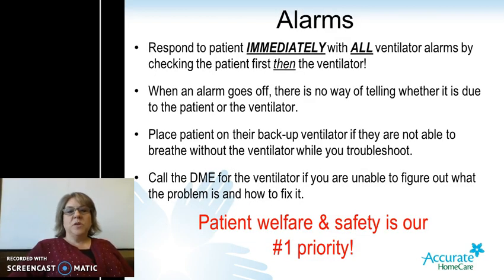Alarms. We need to respond to the patient immediately with all ventilator alarms by checking the patient first, then the ventilator. When an alarm goes off, there's no way of telling whether it's due to the patient or if it's a problem with the ventilator. Place the patient on their backup ventilator if they are not able to breathe without the ventilator while you troubleshoot. You can always call the DME for the ventilator if you are unable to figure out what the problem is and how to fix it. Patient welfare and safety is our number one priority.